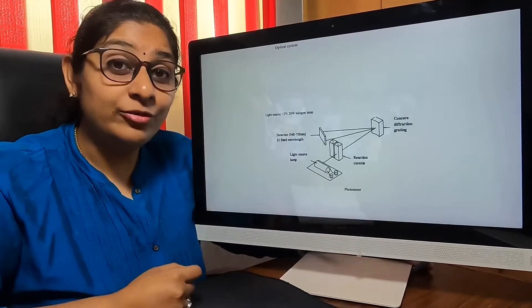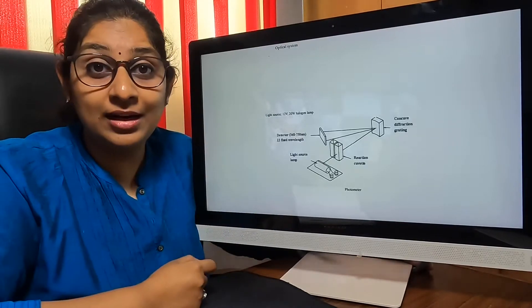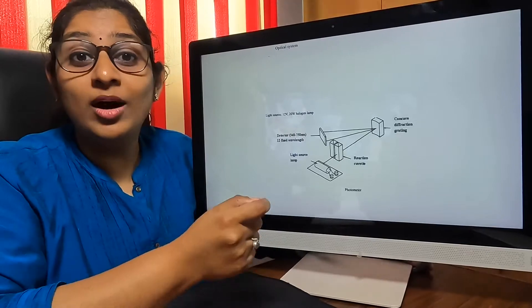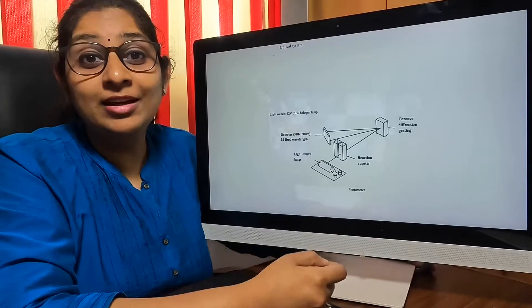We have already explained in detail how this photometric optical system works in a biochemistry analyzer. We will see in detail what are the other things specifically used in this Durabi machine for having a better understanding of how this optical system works.